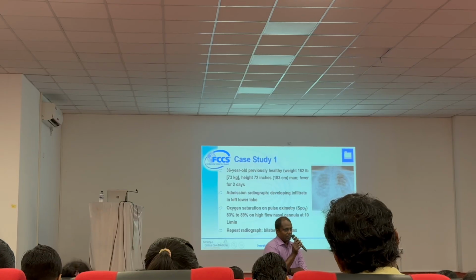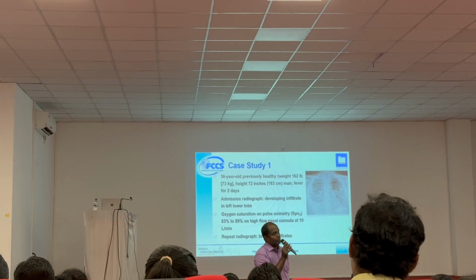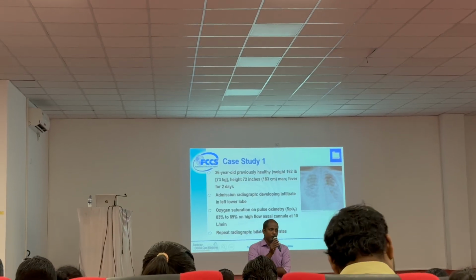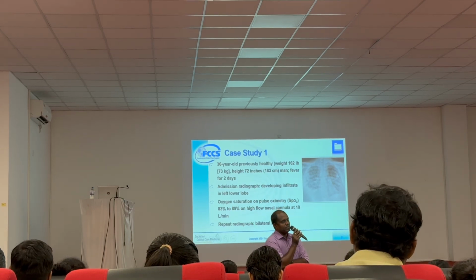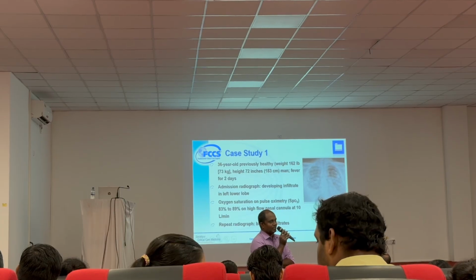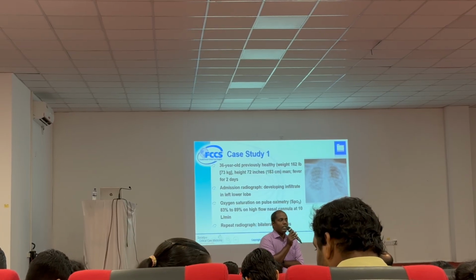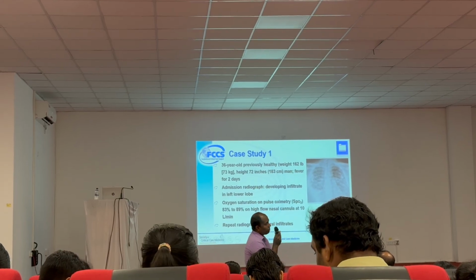If you prescribe 500 ml of tidal volume for a patient, he needs roughly around 30 centimeters of water pressure to deliver it. If you prescribe 400, then definitely it could be less than 30. So the peak pressure or plateau pressure, whatever it is, is directly related to the tidal volume.